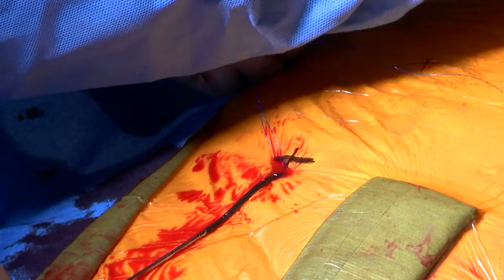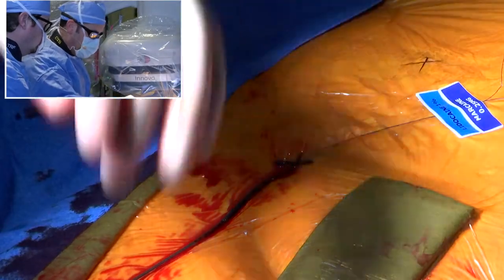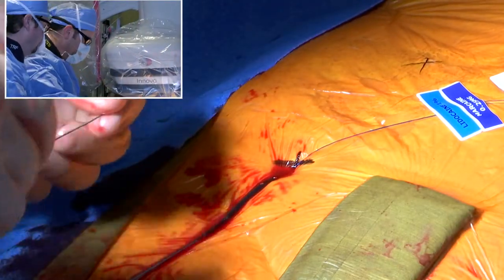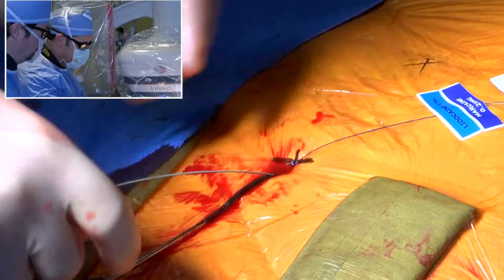And then we use some regular stickers here to keep these organized and out of our way so they don't get confused and they don't get tangled up. Okay, so now we're going to put a wire back through the device, which maintains access in the artery. We're going to walk this device out, put the second device in, and do a very similar thing. And I'm deploying these essentially at the 11 o'clock position and the 1 o'clock position, kind of like an X, so that it gathers the artery back up when we're done.